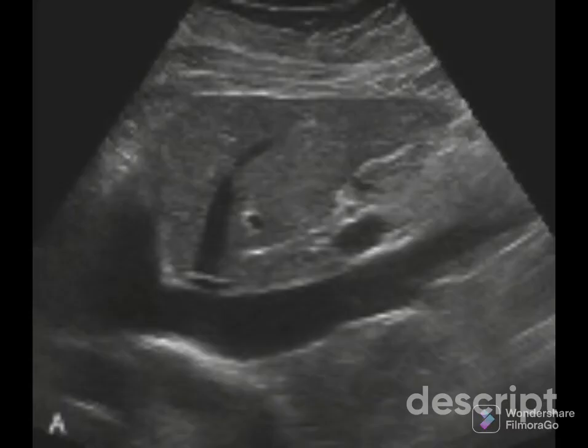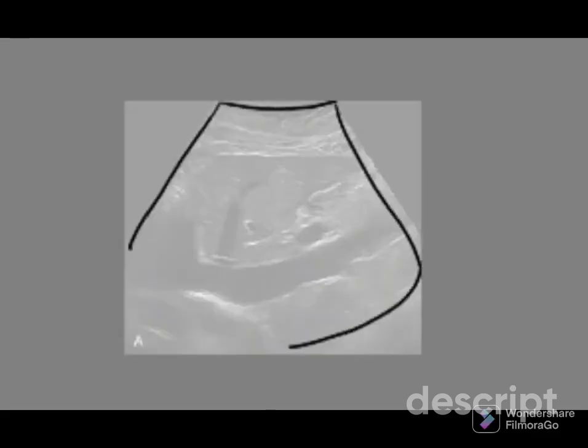Some protocols may have sag distal IVC in it, so we are going to go over that. So for distal IVC, it's going to be in the same area as the proximal aorta, but remember that veins originate more distal in the body. So when I say distal IVC, I'm mainly referring to the proximal aorta area. So since we're going to be in the proximal aorta area, we're going to be slightly a little bit to the patient's right because the aorta runs along the patient's a little bit to the left side than the right.